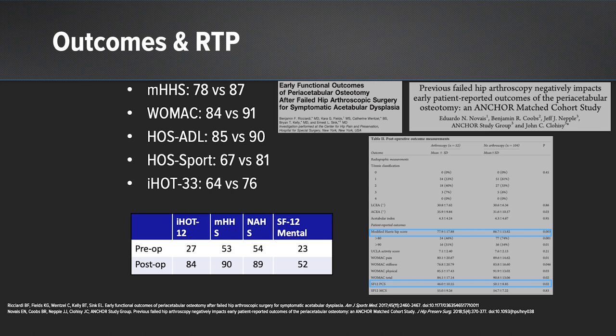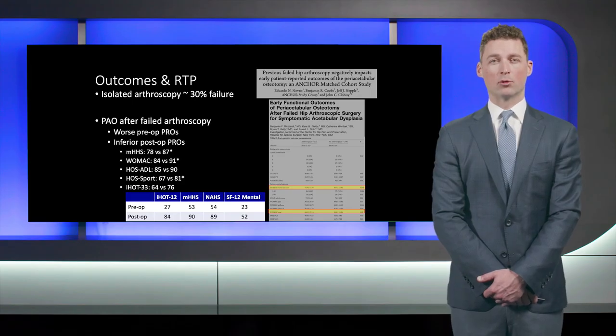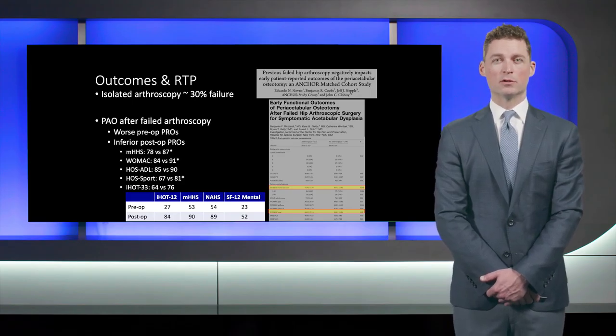So very happy with how this patient ended up progressing through her experience and revision surgery. Having some great suture anchors to really dial in labral reconstruction circumferentially, plus a PAO, is very helpful.